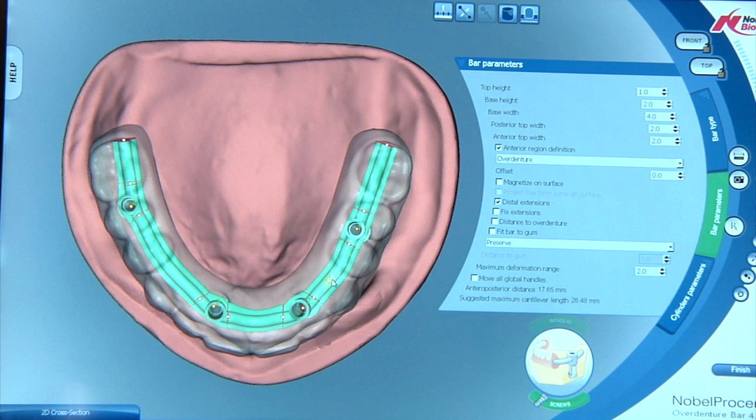As we do that, we can decide do we want to reference the denture on here? Would we like to reference what's known as an intaglio, or would we like to just go through a direct bar proposal? Let's click on our bar proposal choice and you can see that the software automatically starts setting up the alignment for you.